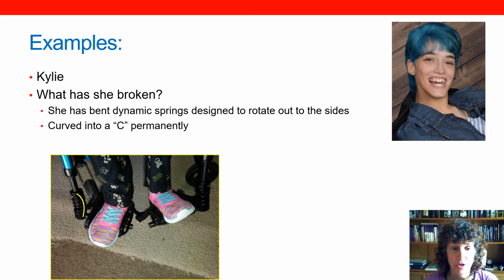Kylie, we saw this picture before, turned this very strong spring into a C with constant pushing against this foot plate. So now the foot plate is out of position and this component needs to be replaced.